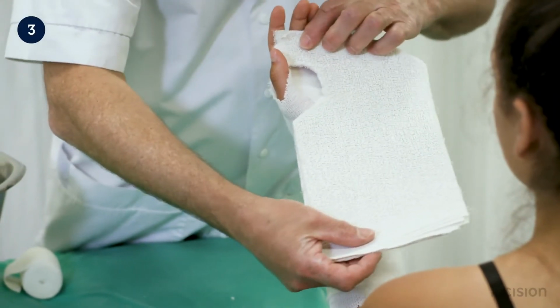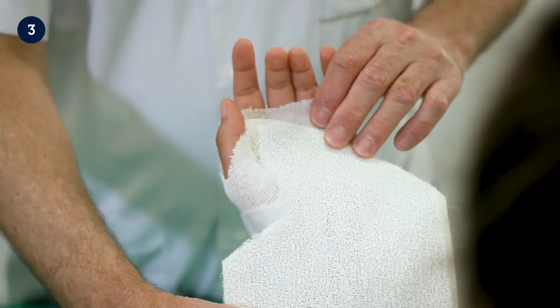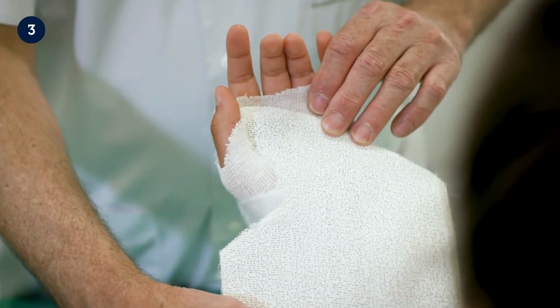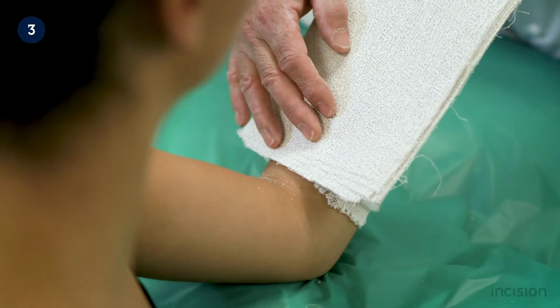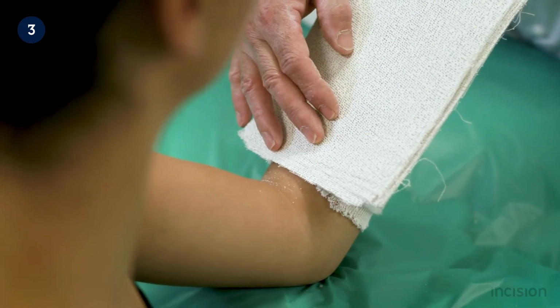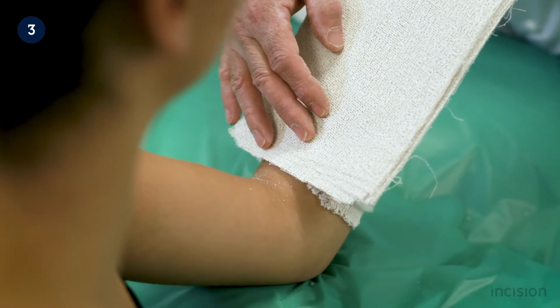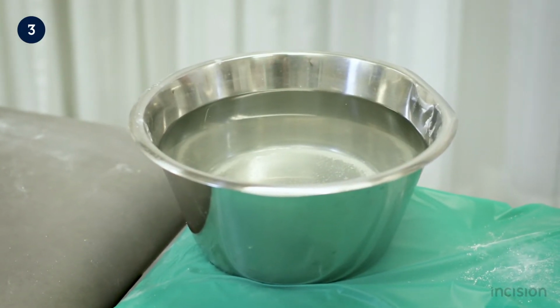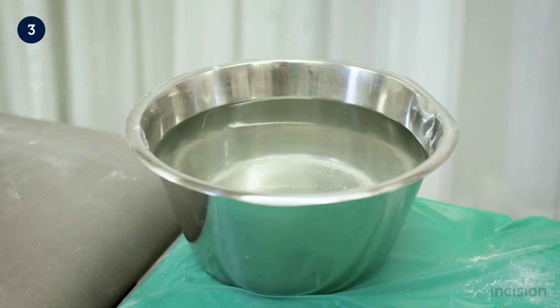How the plaster will be applied while dry is demonstrated. Note that the plaster is adjusted so that it fits in the palm of the hand. The plaster should be applied 2 finger breadths from the elbow crease along the volar side of the forearm and wrist joint. Water at room temperature is used, as too hot water causes the plaster to harden too quickly.